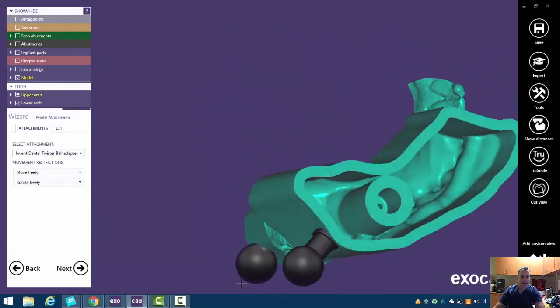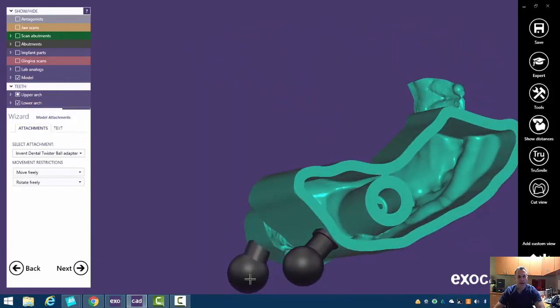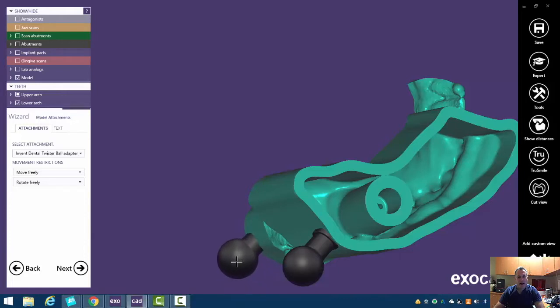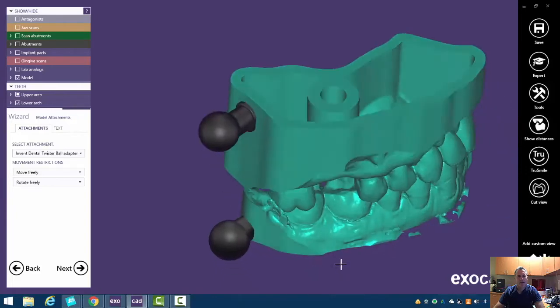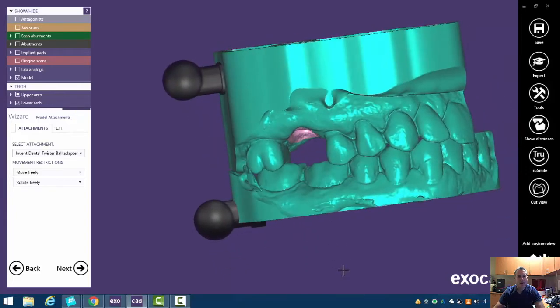The nice thing about it is since it's kind of a twister articulator, they don't have to line up exactly. We want them kind of in the same ballpark.